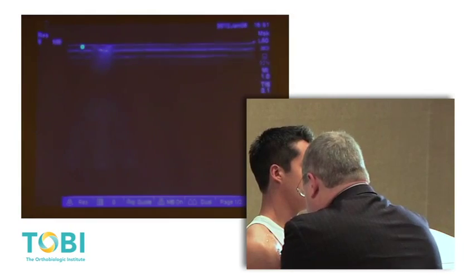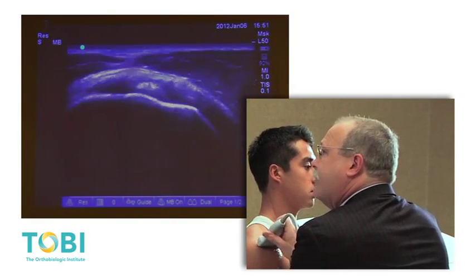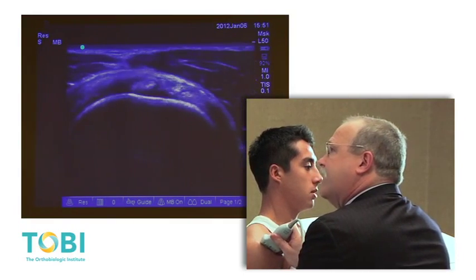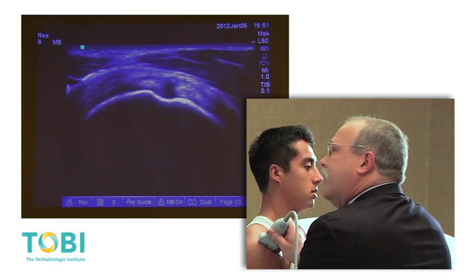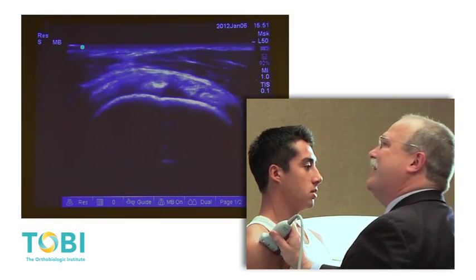Look at the supraspinatus tendon. I always start with their hand down by their side. This doesn't work with everybody, but it works with people with very little lateral body wall mass, like Kyle. You don't have too many Kyles as patients, I understand.